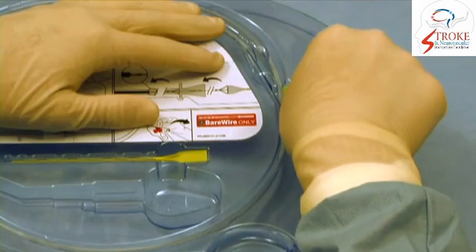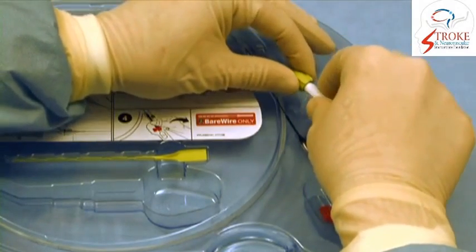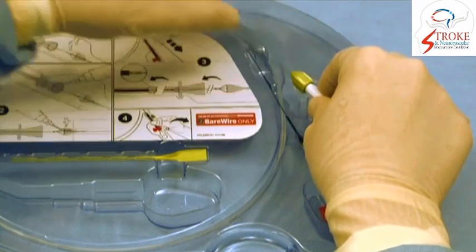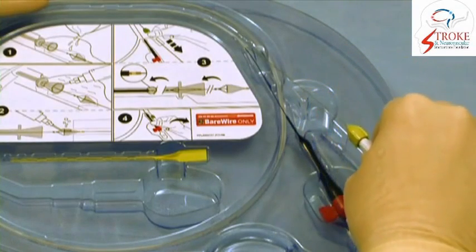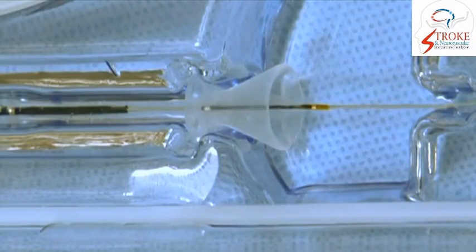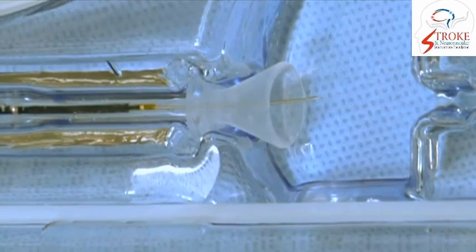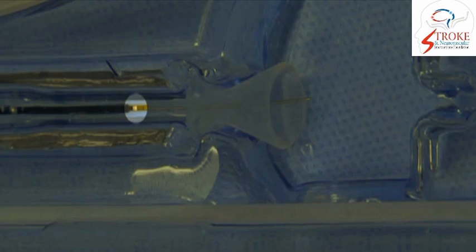After flushing, the torquer is tightened on the wire so as to withdraw the filter into the delivery catheter. Now the wire is withdrawn, the filter comes back into the delivery catheter, the golden tip marker perfectly aligns with the catheter.